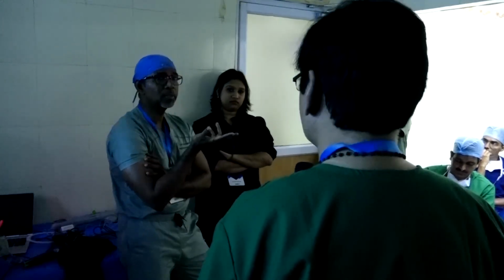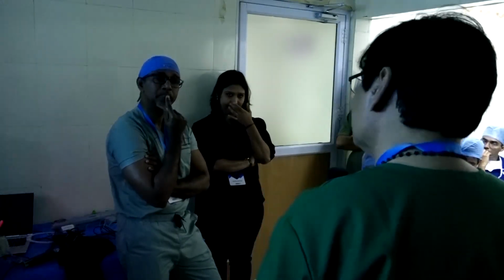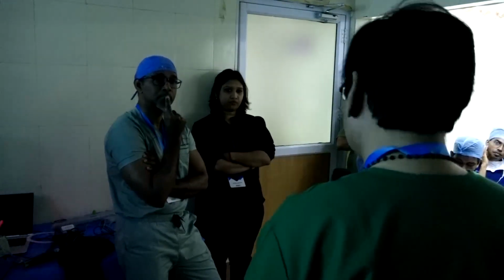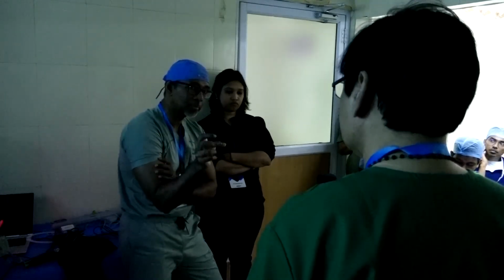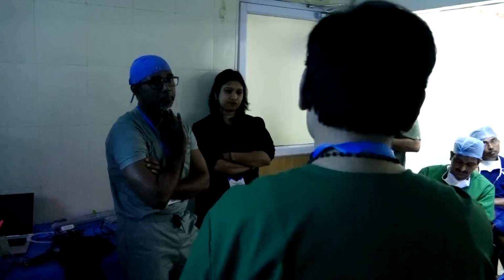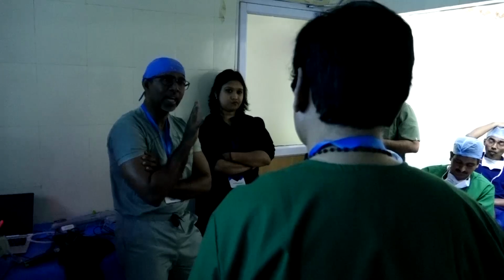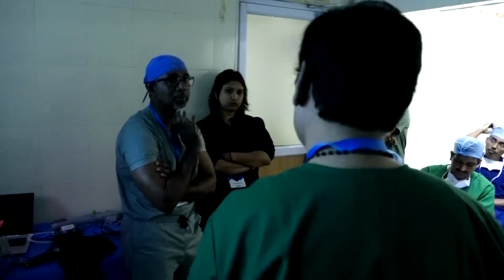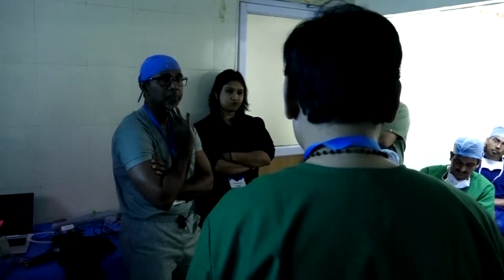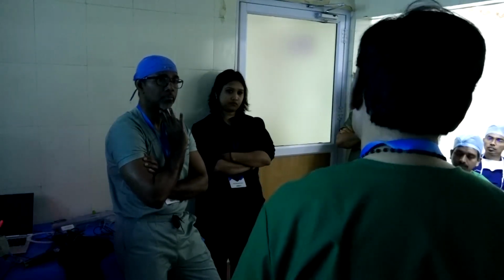Yes, true, recurrence is high. I have seen it in focal lesions. I did IVL actually, because I did not see atherectomy. With atherectomy, yes, true, once you reduce the volume, the recurrence rate is very low in calcific lesions.